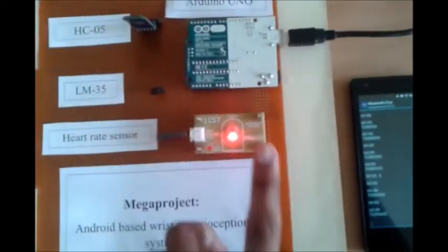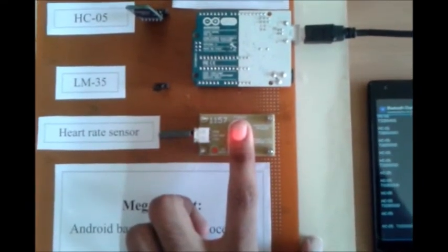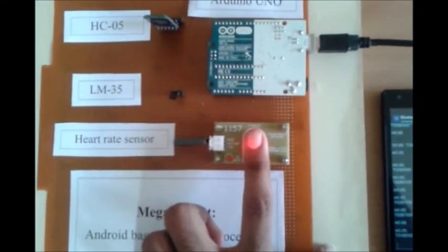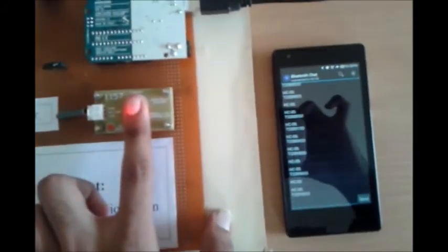It is showing some data. Temperature is showing 32. Signal is showing 0. Okay, signal is 0, so let me put my finger on the sensor. Now the signal is glowing, and also the LED is glowing with respect to my heartbeat. Now it is giving the output.